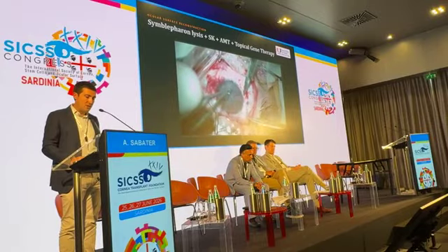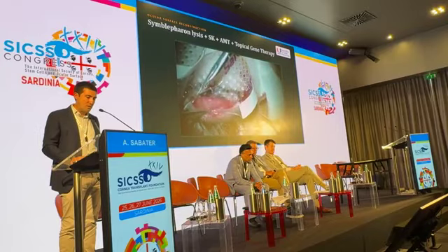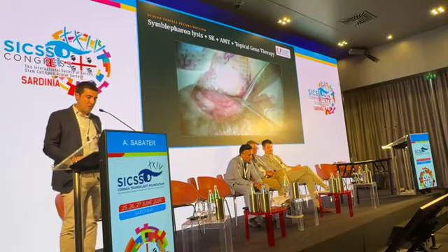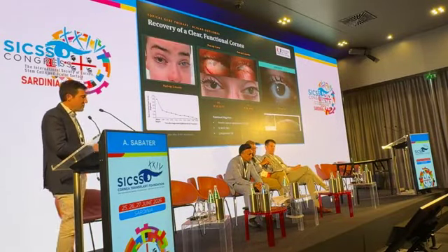We use amniotic membrane to cover the cornea and also the tarsal conjunctiva, so we suture amniotic membrane in there too. Right after the surgery, we started the topical gene therapy. We didn't have data, but we know that corneal epithelium usually replenishes every 7 to 10 days, so we told the FDA we would do it once a week, and that's what we did.